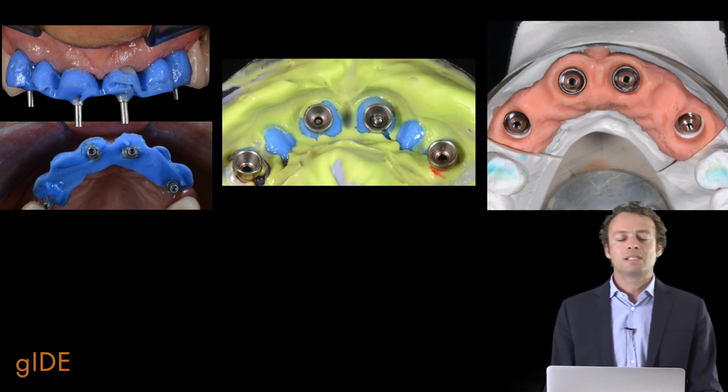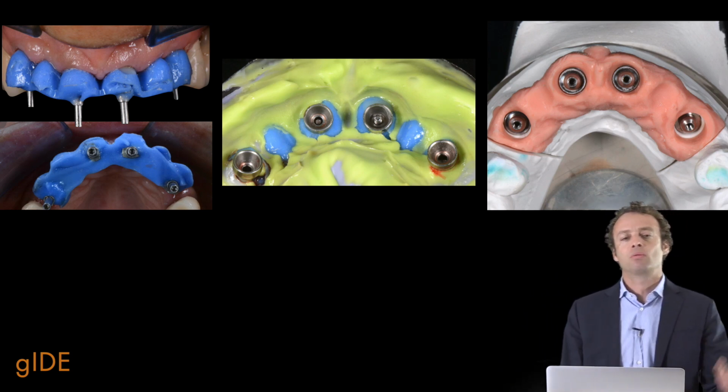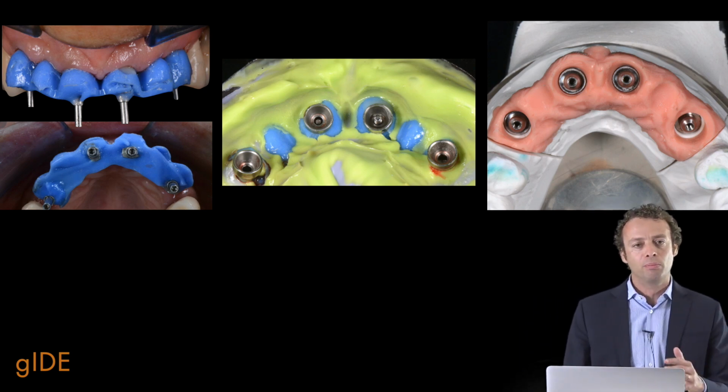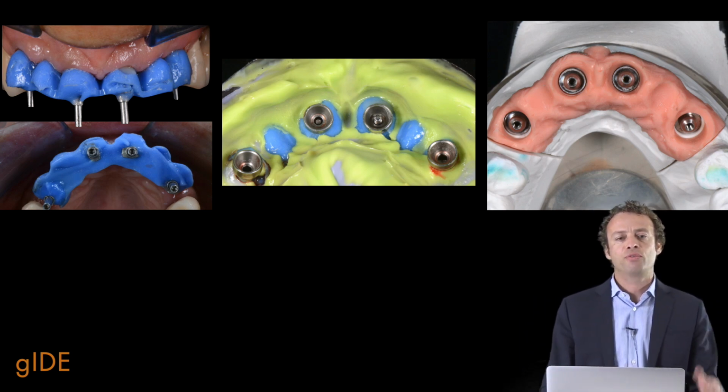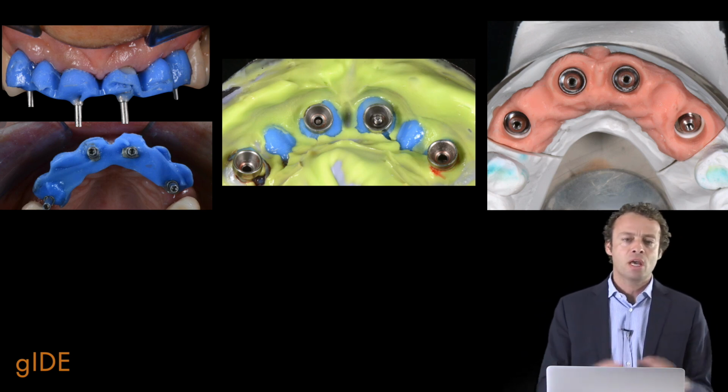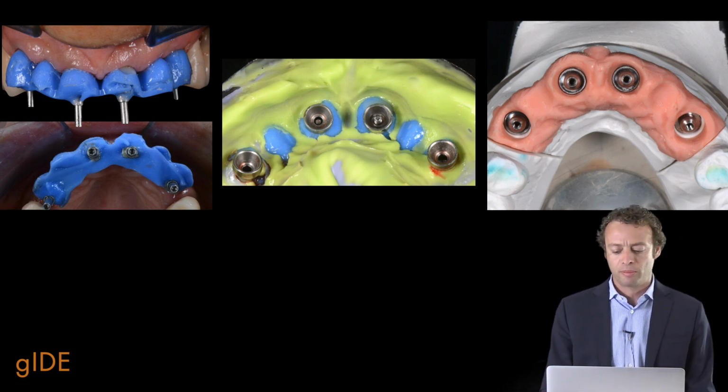But nowadays I like also to work with a digital workflow. So I manage also this case with a complete digital workflow. And it is for 2 or 3 years that I always take a double impression of my patients in order to compare the two different approaches.